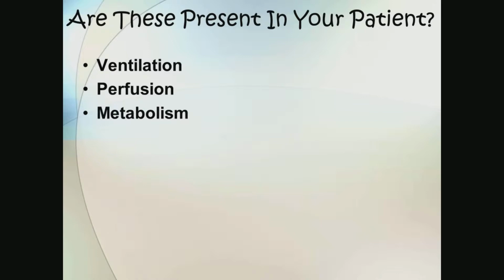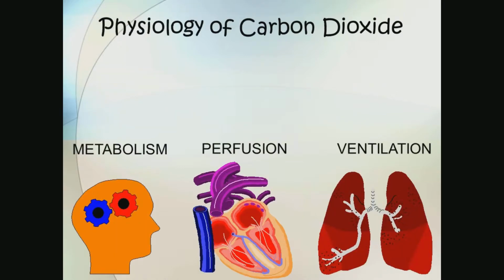But if your patient has ventilation, which I'm hoping they do, otherwise we have to talk. If your patient is being perfused, or if they have metabolic activity, we should be monitoring their end-tidal CO2 level, because all three of them play into the process. We normally just think of the one on the right, but in reality, CO2 is very perfusion dependent, and it's very dependent upon metabolic processes also. If your metabolic rate is reduced, your end-tidal CO2 is going to be reduced also.